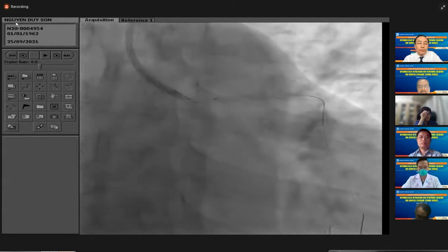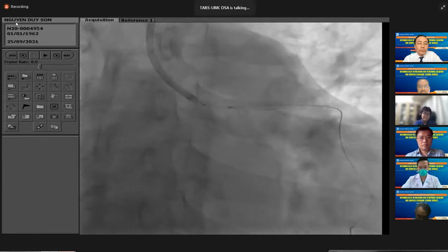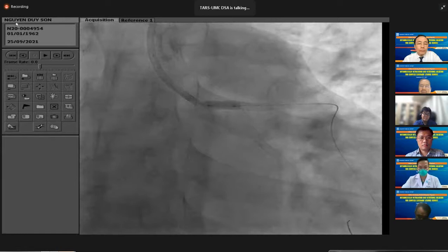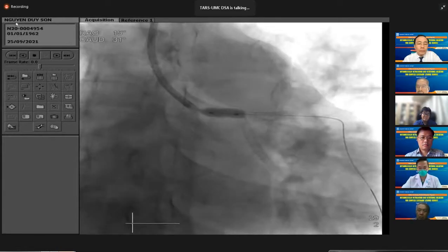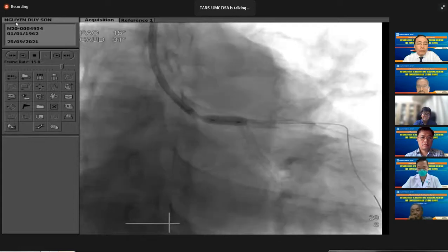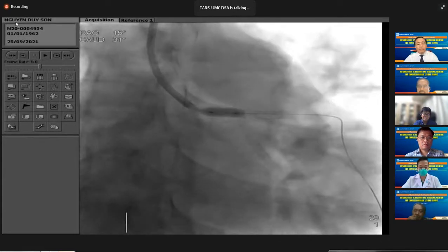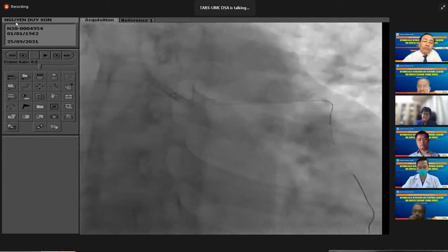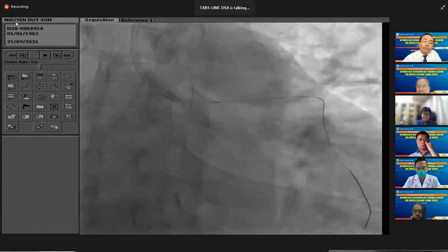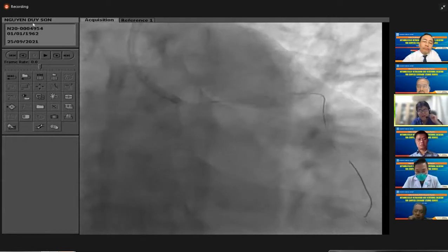Okay, again. Dr. Kuramisu, you have some cases where the stent in the ostium is prolonged. I mean that it's longer than at the beginning because we have the high pressure balloon. So in this case, do you worry about this or not? The stent in the left main?